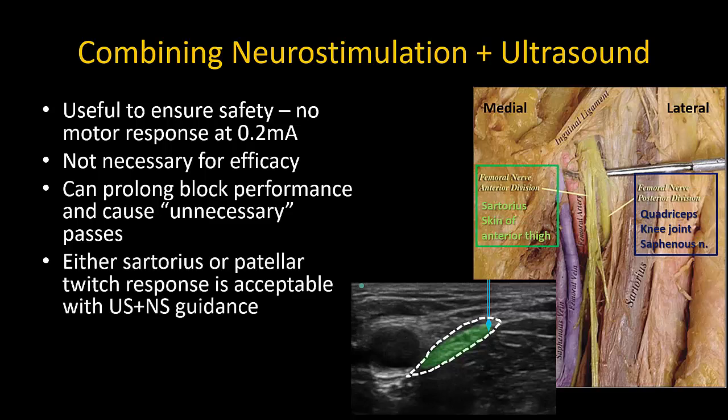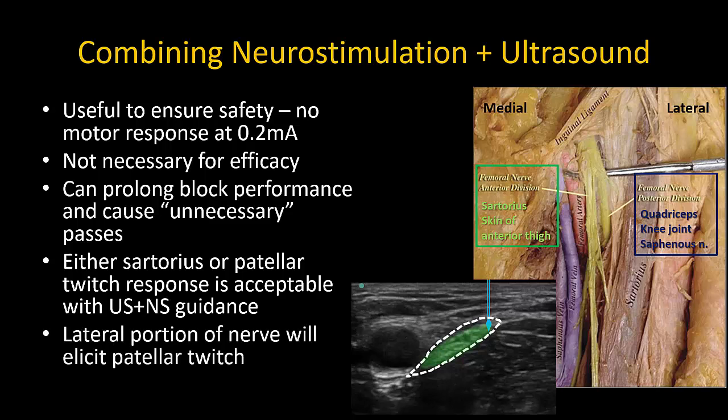If seeking a motor response, note that either a sartorius or patellar twitch is acceptable when this is combined with ultrasound visualization. Ultrasound visualization is essential to ensure the endpoint of good spread. Contact with the lateral portion of the nerve, as recommended, and not the medial portion, will elicit a patellar twitch, as this is the location of the posterior division that innervates the quadriceps muscle rather than sartorius.